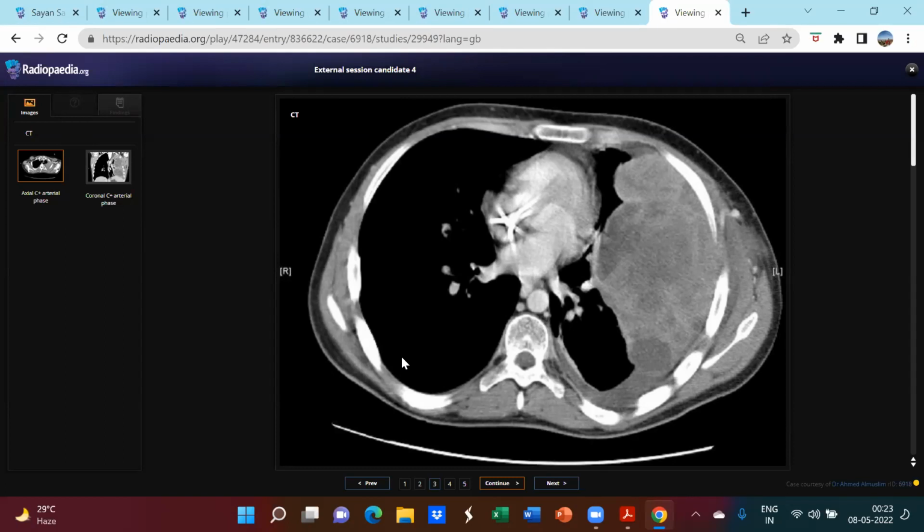Well, I'm talking about the depth from the skin. You can show me on the screen. We're talking about ultrasound guidance. So under ultrasound guidance, one would prefer a biopsy to be taken from the central part of the lesion. Why are you choosing that area?